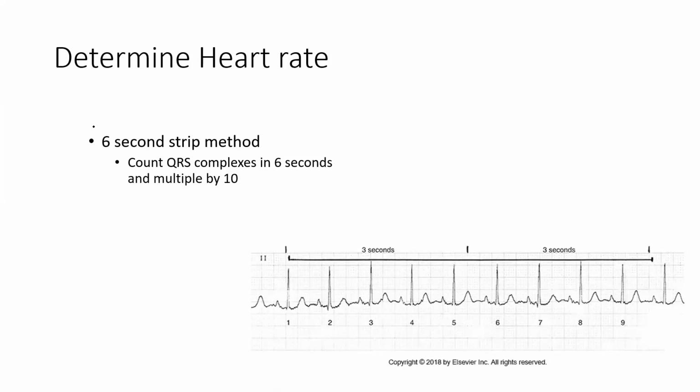All right, so here we go. The QRS complex, let's see. Get back to the markers here. Go back to the red. Right here, that's one. Right here, that's another one. So you count these in the 6 seconds, which are 30 big blocks. We have 1, 2, 3, 4, 5, 6, 7, 8, 9. Okay, we do not count this one. It is outside of our 30 block window.